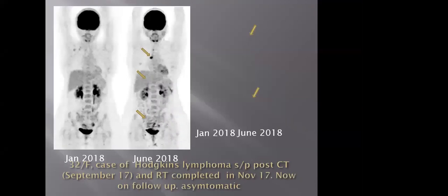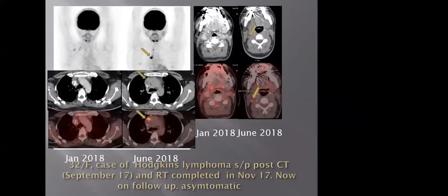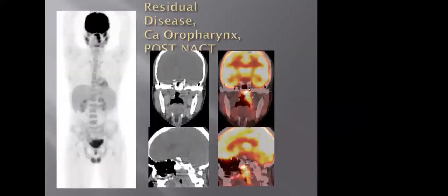This was a case of Hodgkin's lymphoma, post chemo and radiation. This was a very old case. And now the patient came just for a follow-up and we picked up, next slide, a few nodes in the neck, but a prominent node in the right prevascular mediastinal space. Next slide. So that was a case of early disease recurrence in an asymptomatic case.